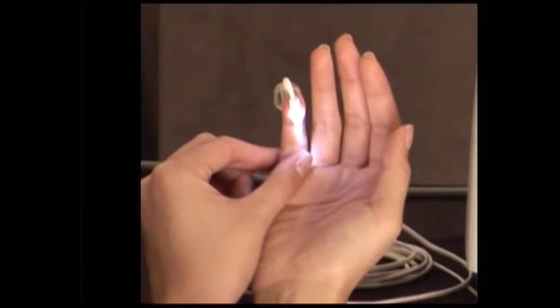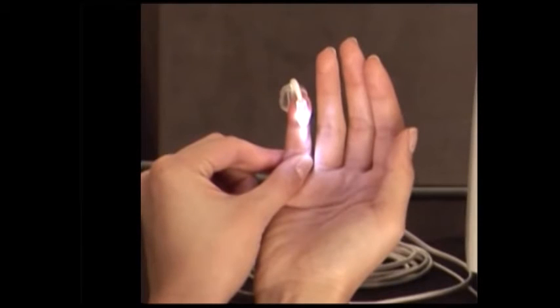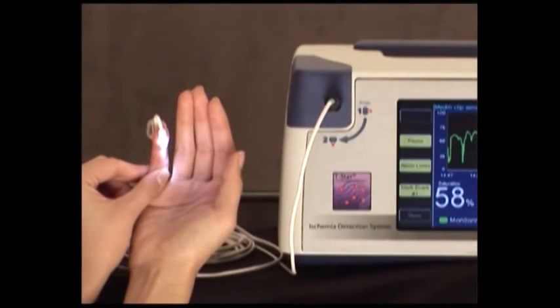To demonstrate the unmatched and rapid response of the T-Stat, we will block blood flow to a digit by squeezing the arteries running along the sides of each digit. When blocking arterial flow, tissue saturation drops rapidly over only a few seconds and rapidly falls into the abnormal range. Here, we have set the alarm limit at 35.